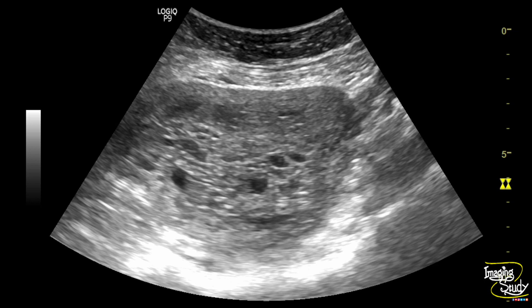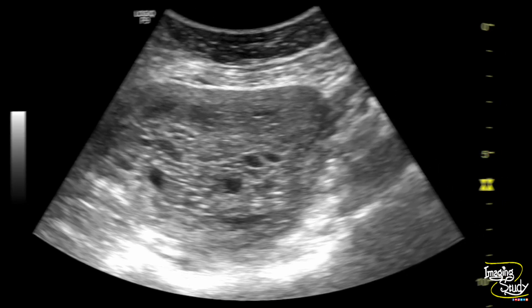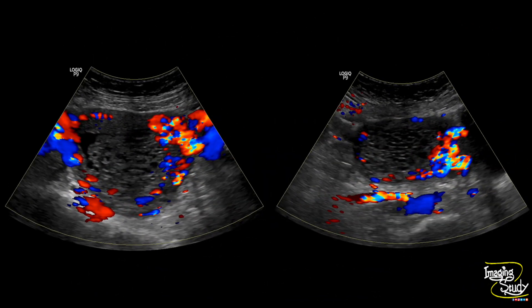Here is the grayscale transverse section view — you can see the central intrauterine mass with diffuse cystic spaces forming the snowstorm appearance. This is the color Doppler view, and you can see the tornado vessels at the left anterolateral and the posterior wall.